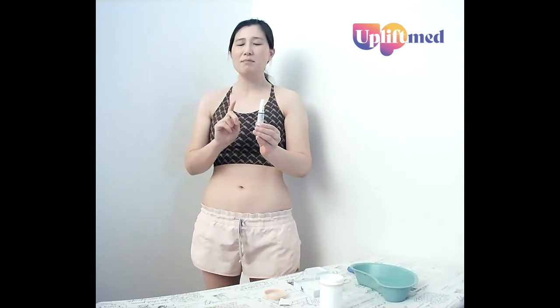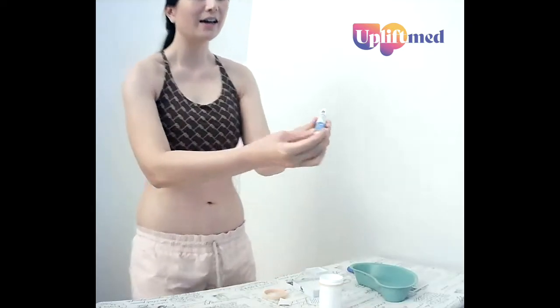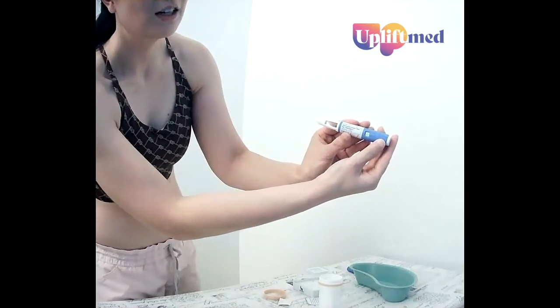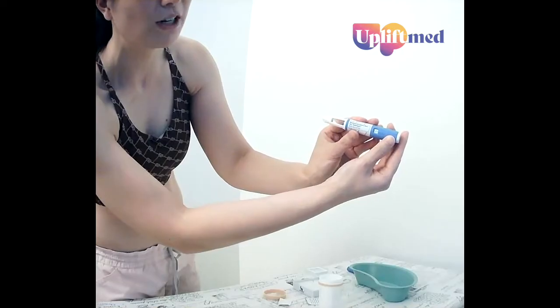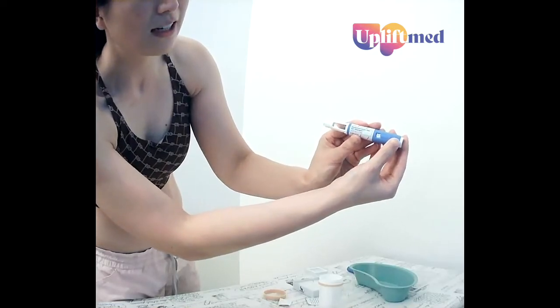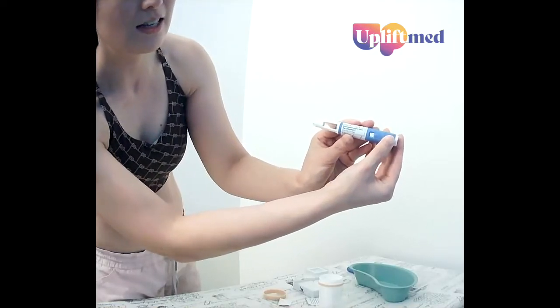Each time you start with a new pen, we need to check the flow. To do that, we need to dial up our pen two clicks to the flow symbol — that's the two broken lines. Click, click. Now you can see the flow symbol.